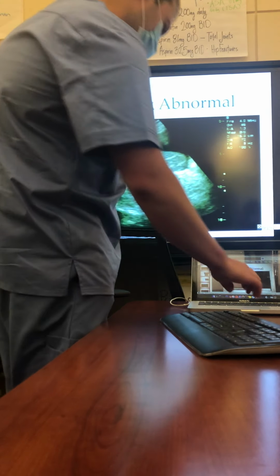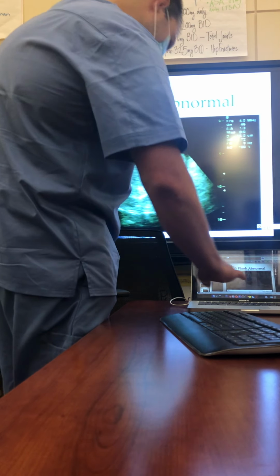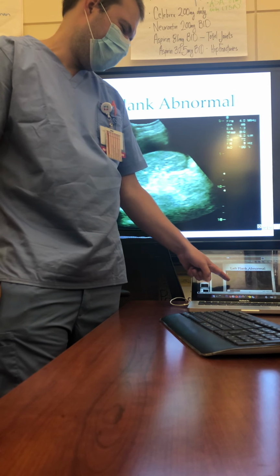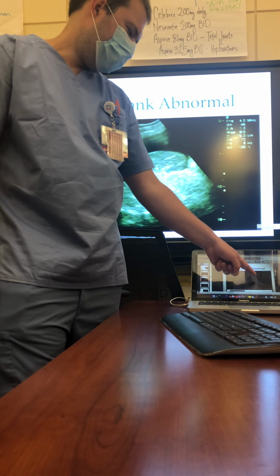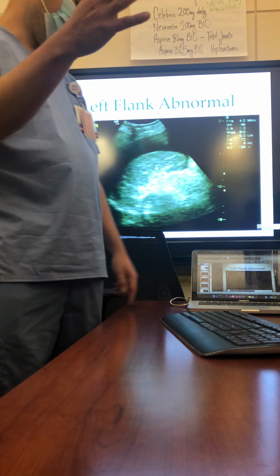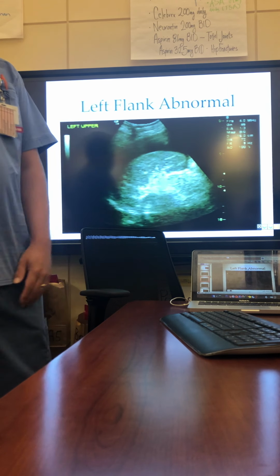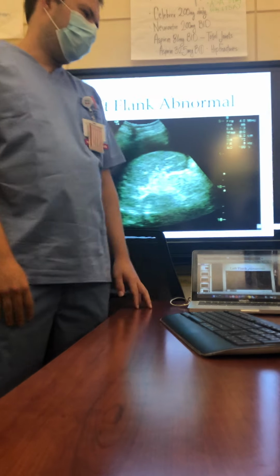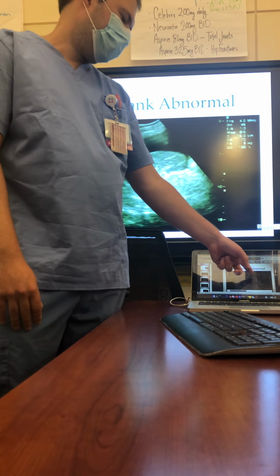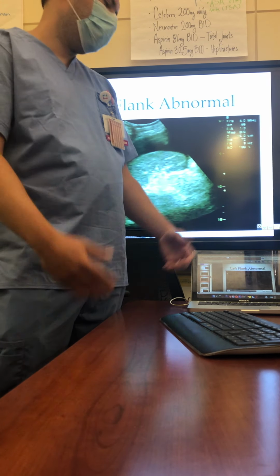All right, this one is a lot of blood. More than the last one. So this is spleen here. You can just see all of this anechoic, all of this black around it. You can even see, so this is kidney right here that pops up at the end. You see all of this. You can even see something within, which, in the setting of trauma, would be like a clot. We also sometimes see this with like SBP in your cirrhotics. But you see basically stuff floating and flapping inside the ascites or the blood.